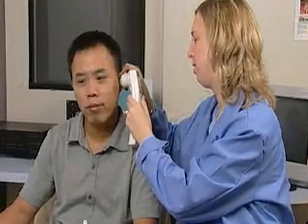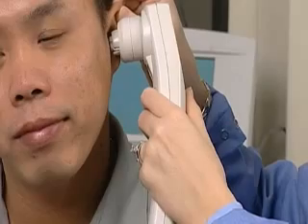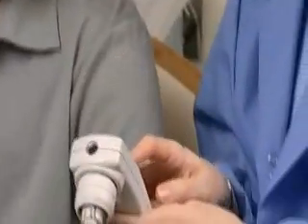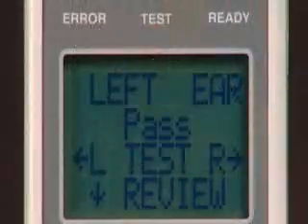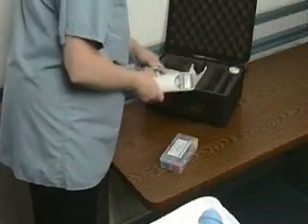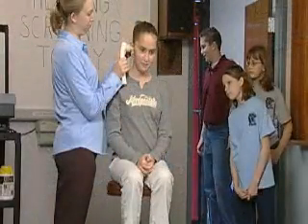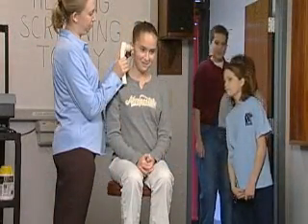The AeroScan is the only truly hand-held OAE system on the market today, capable of performing a complete OAE test in as little as six seconds and instantly providing test results on screen and on paper via the included printer. Completely portable and battery operated, this system can be used in almost any environment to test everyone from infants to adults.